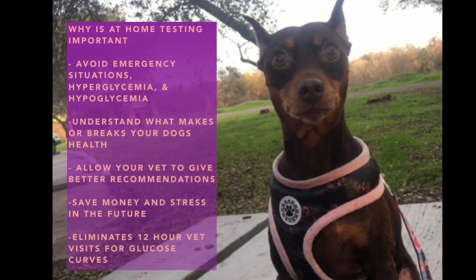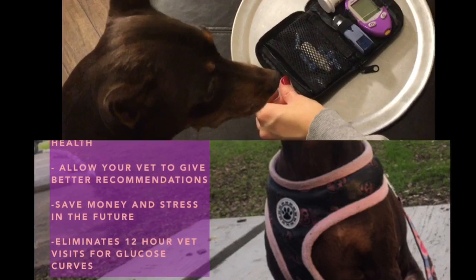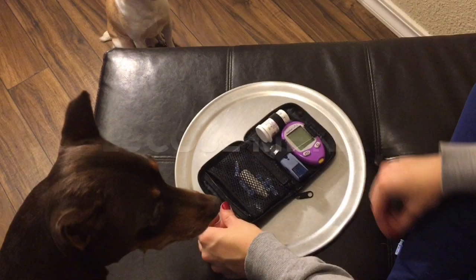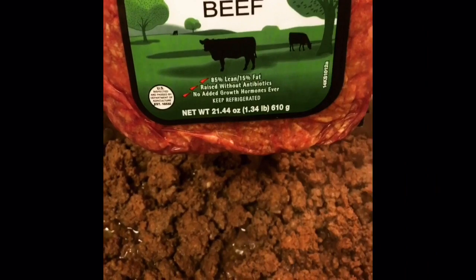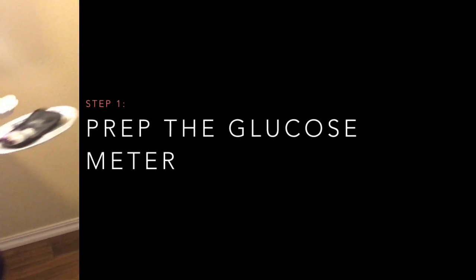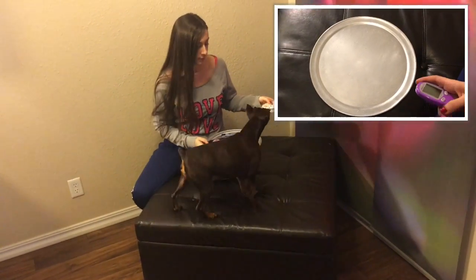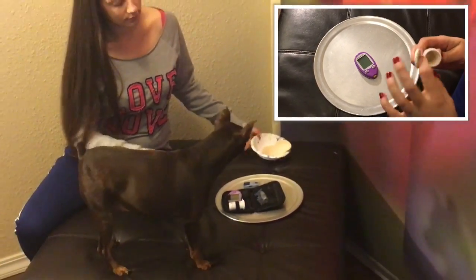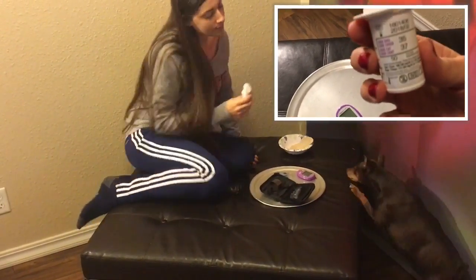Thank you for joining us. The first thing Penny and I do to get started is we prep her glucose meter. This is super important because the glucose meter has a two-minute window that you get to take blood in. So if you don't prep it before and have it waiting for you, you're going to be racing the clock trying to get blood from your pup.